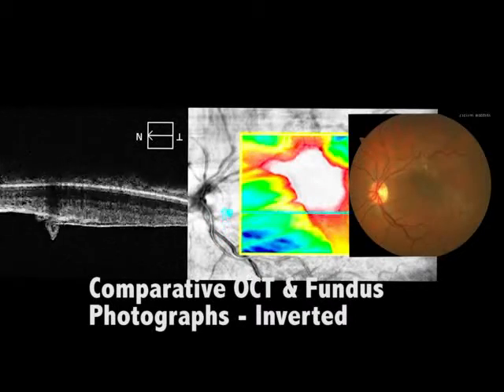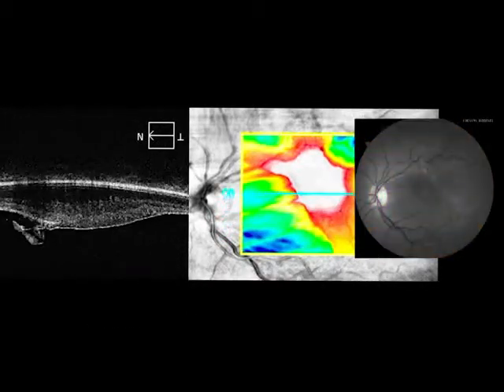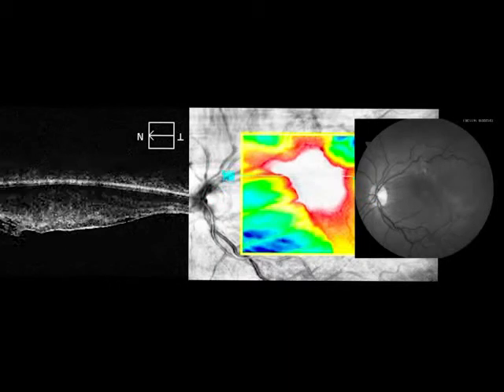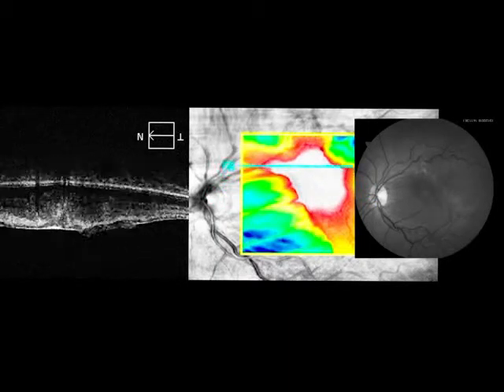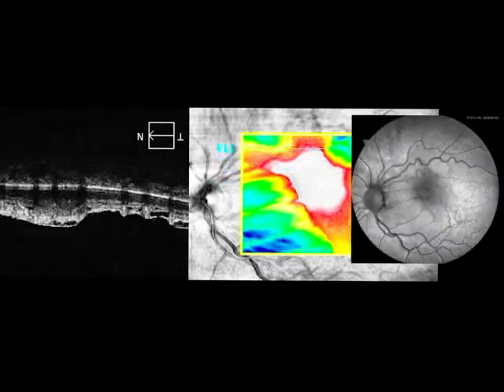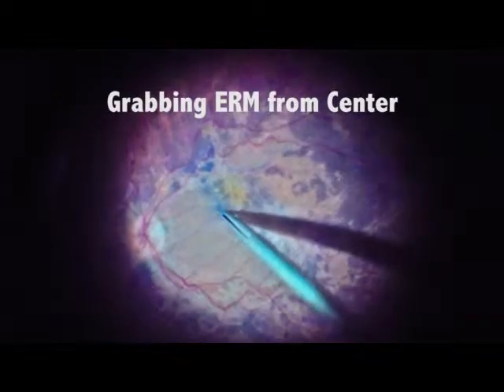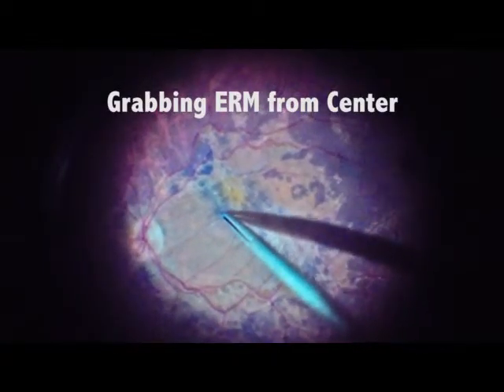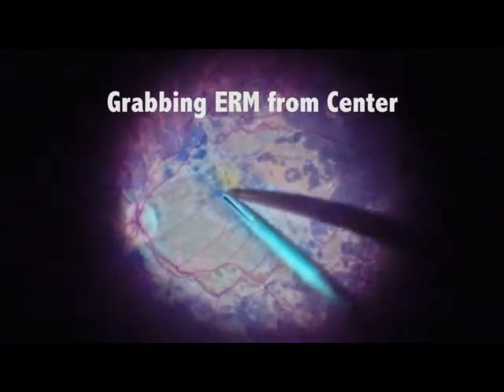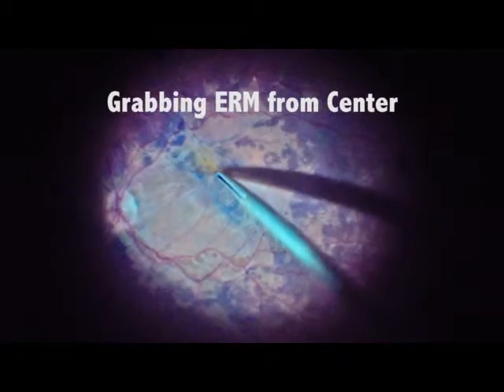A comparative inverted OCT and fundus photograph is superimposed to help us decide where to start the epiretinal membrane peel. The autofluorescence shows very distorted retinal vessels, so we decided to peel the epiretinal membrane from the foveal area because we could use the vectorial side forces to spread it away from the retina evenly.